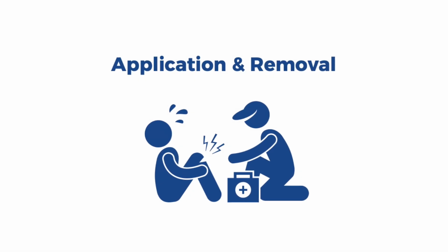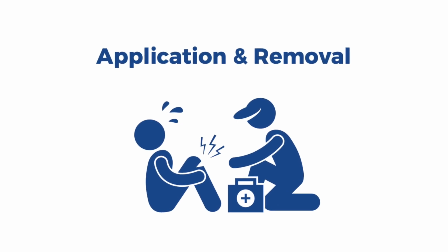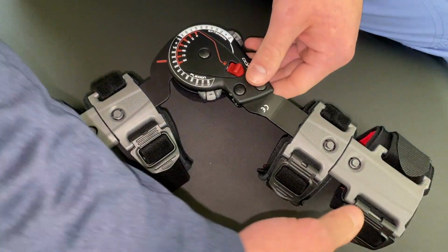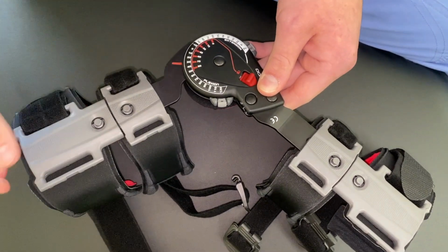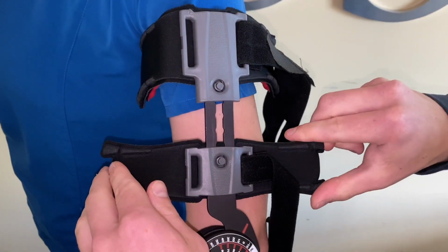This brace will typically be appropriately modified and customized to you and applied at the time of surgery or in clinic. Before applying your brace, make sure that each quick clip is fastened. There are a few modifications that will likely be made on the length and width of your arm. There are 4 cuffs of this brace, each of which is modifiable to your arm.